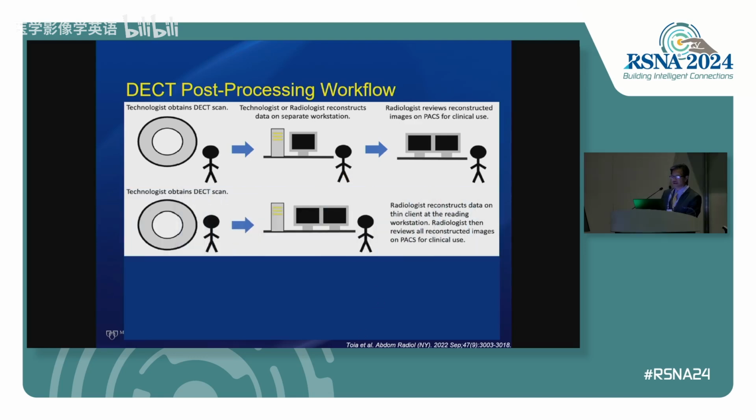The other way is that you could have a thin client where the data gets sent to, and the poor radiologist has to do their own post-processing. Neither workflow is really very conducive to a heavy and busy workday.